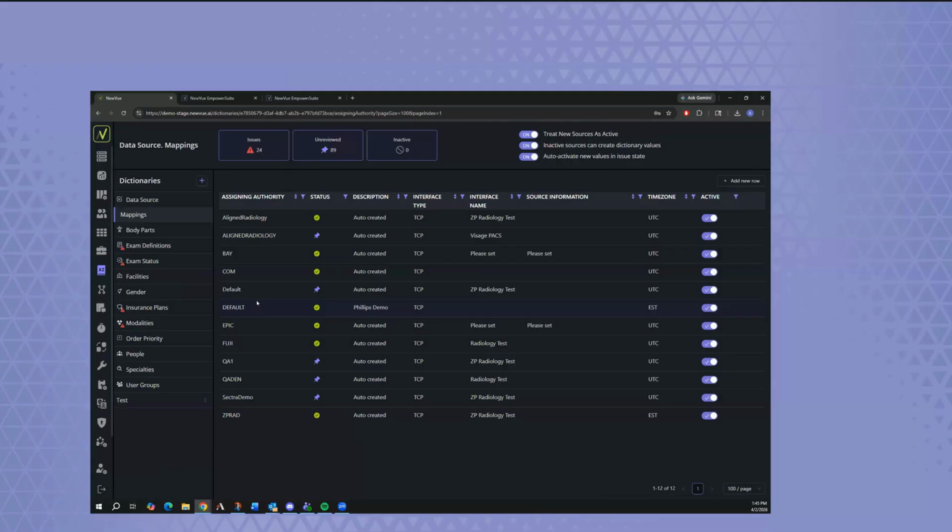In general, when you're setting up sophisticated or complex workflows and distributions, you're trying to achieve different kinds of outcomes, whether that's highly specialized reads, load balancing, equitable distribution, or reduction of cherry picking. Those are all goals you have for your radiologists and radiology departments. You're trying to accomplish productivity and fairness.